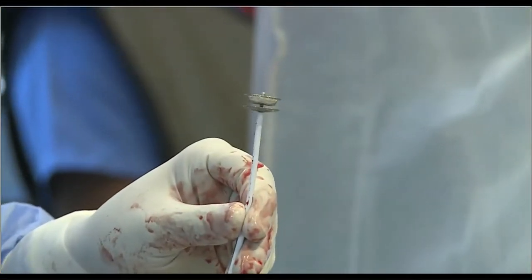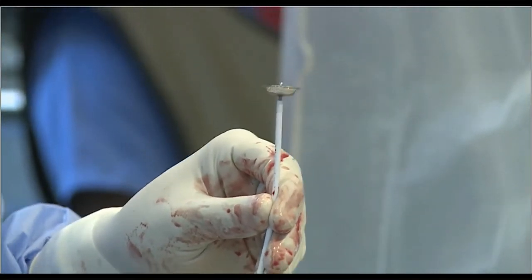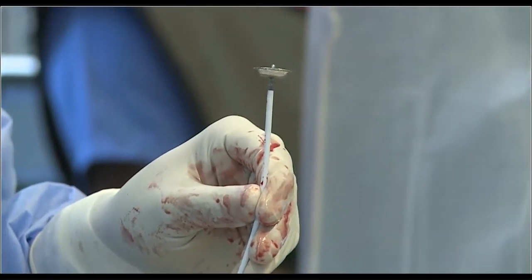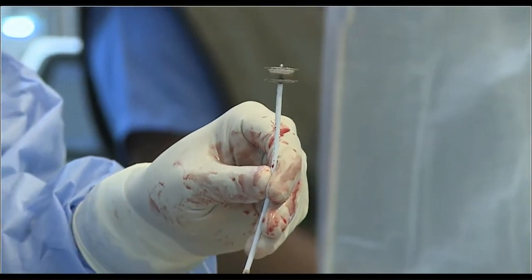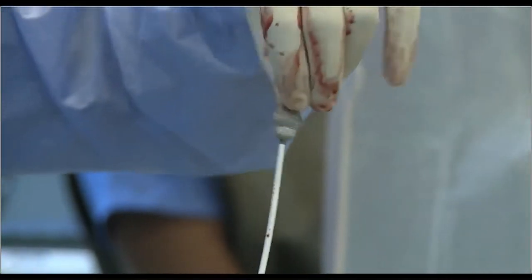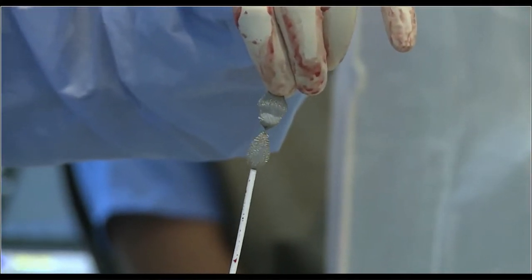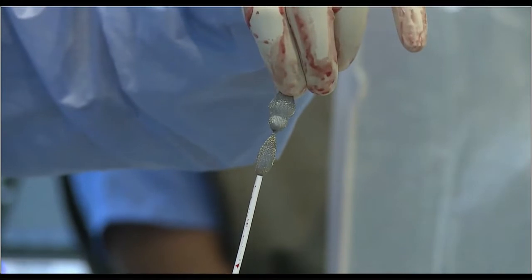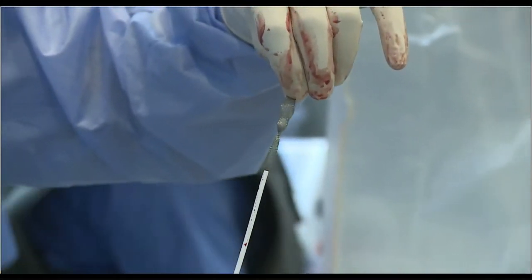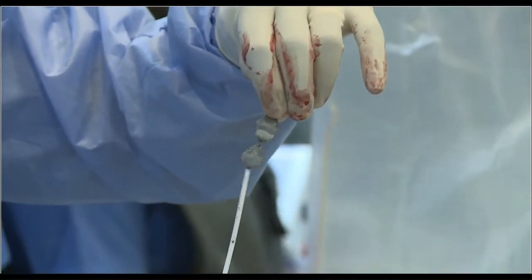The distal end of the MFO is like an ADO, but it is very short in its length, and then it has got a retention skirt on the right side. If you carefully observe, there is a single layer fabric in the middle belly. This fabric is there in the larger 3 sizes, that is 10-8, 12-10 and 14-12, whereas the smaller devices like 6-4, 7-5 and 8-6 do not have a fabric.